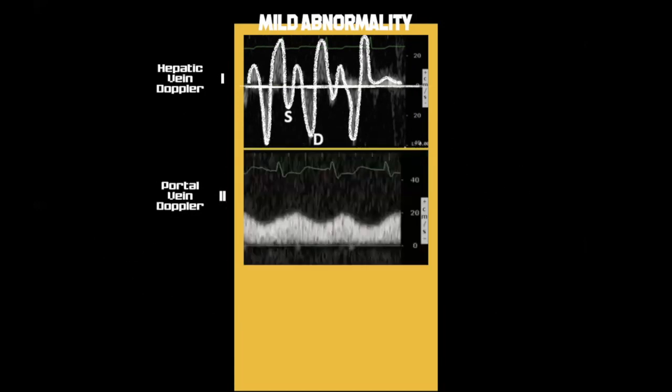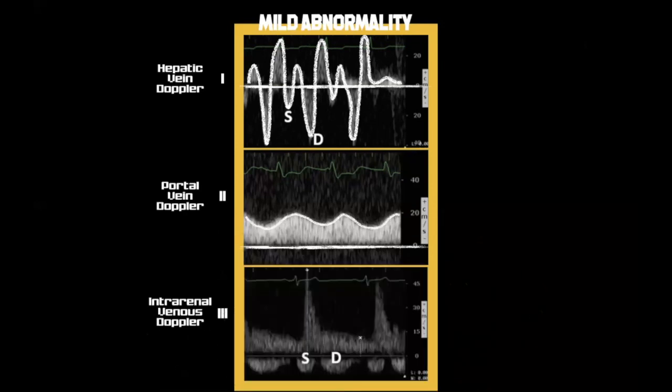This is a result of lots of different things, but it's essentially gradually increasing venous pressure, which is reducing the pressure gradient for systolic flow traversing down the hepatic veins. Whereas if you look at the portal venous flow, it will start to noticeably become more pulsatile, and you start to get much more variability. I believe the cutoff that Philippe Rola and Andre have described is about 30%. Once you see a change between your baseline velocity and your peak velocity of your portal venous Doppler of more than 30%, that starts to be a mildly abnormal portal venous flow. And your intrarenal venous flow is quite interesting.